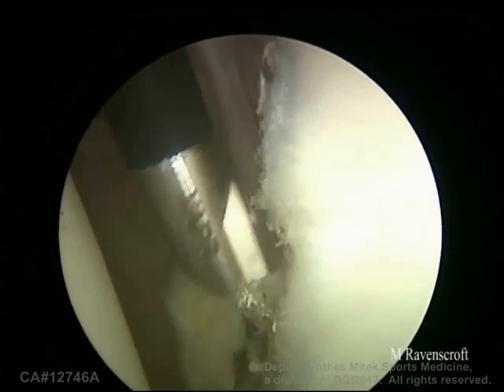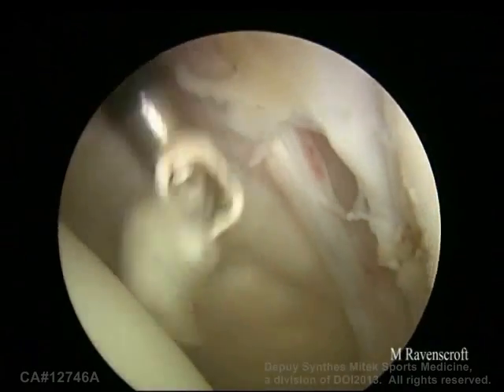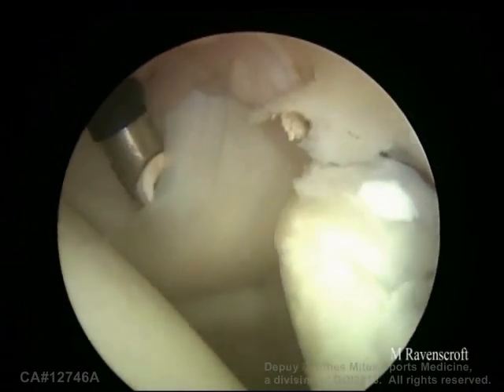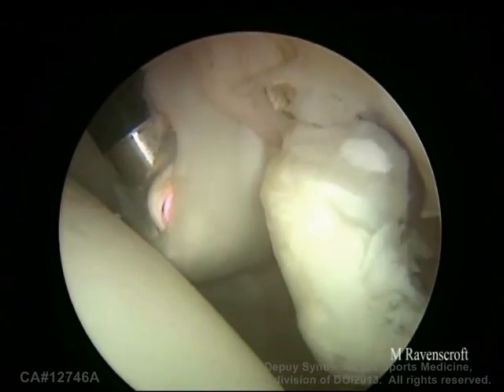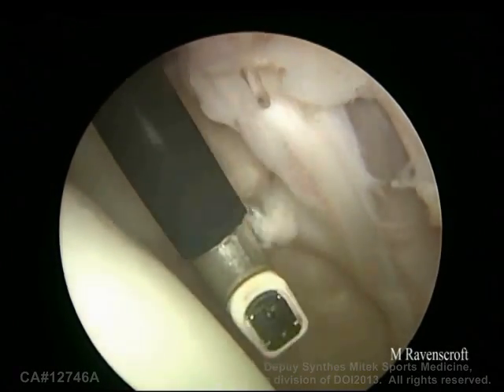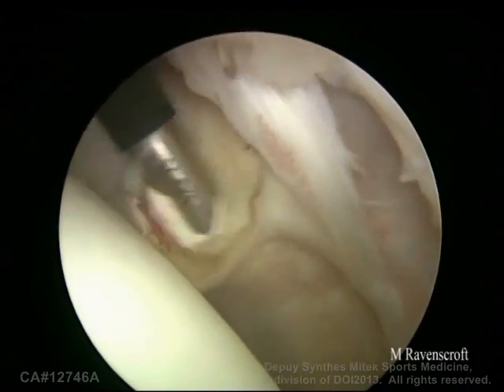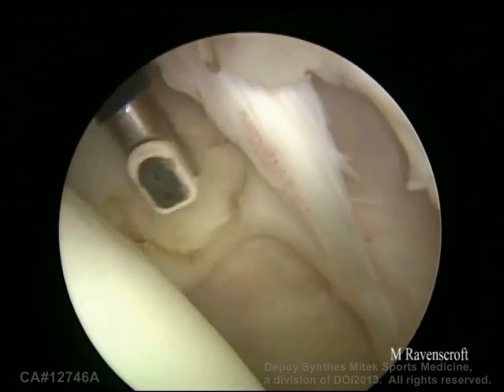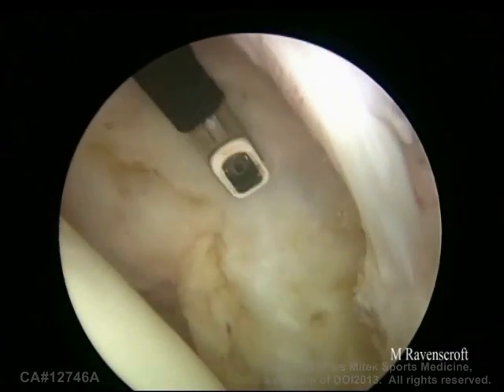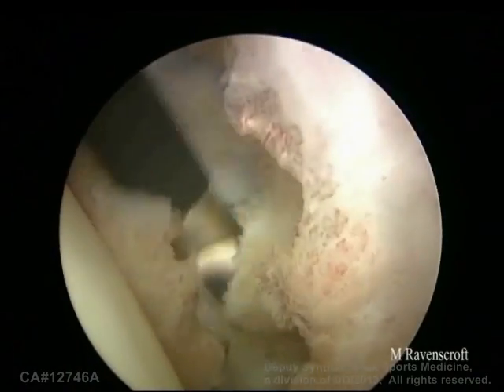Firstly, I'm just going to remove the cartilaginous flap off the anterior part of the glenoid. And then we're going to resect the middle glenohumeral ligament and start to clear the capsule off the inner aspect of the subscapularis tendon. It's important to remove a lot of this tissue as it will get in your way when you do your subscap split. So we just use the CoolPulse to create the plane between the capsule and the subscap.